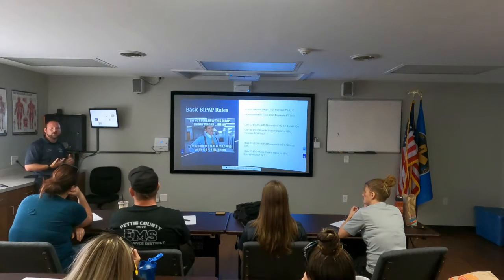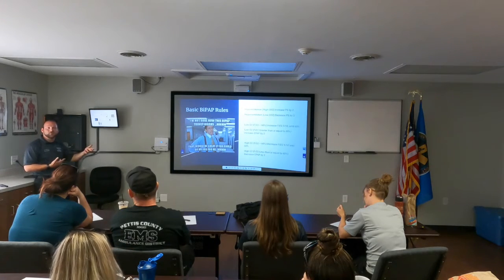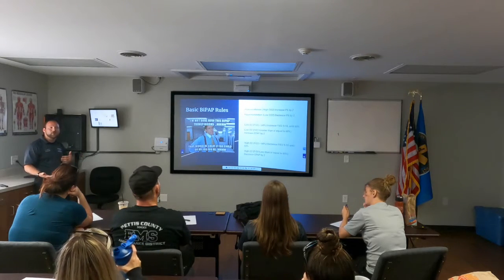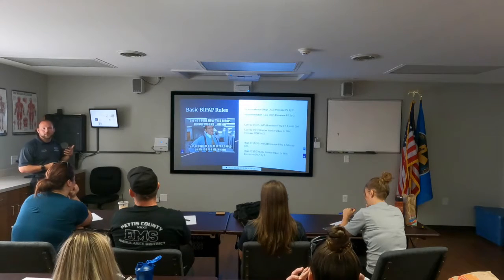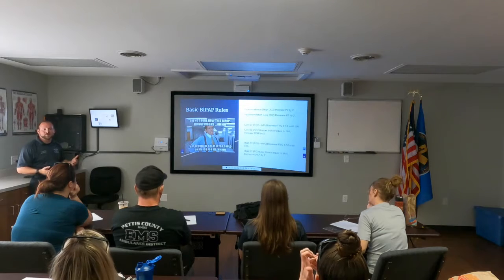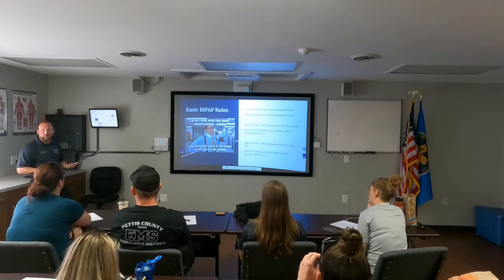And you can do that with our vent very easily. Set it to CPAP. The pressure support's already set at 0, with your EPAP already at 5. Just add your pressure support at 5, that way it's a constant pressure. Slowly increase that to where they were comfortable before, and then increase your PEEP after that. Again, always make sure that your FiO2 is adequate for your patient as well. Make sure we're always keeping oxygen saturations above 90% as best as we can, ideally anything greater than 94.